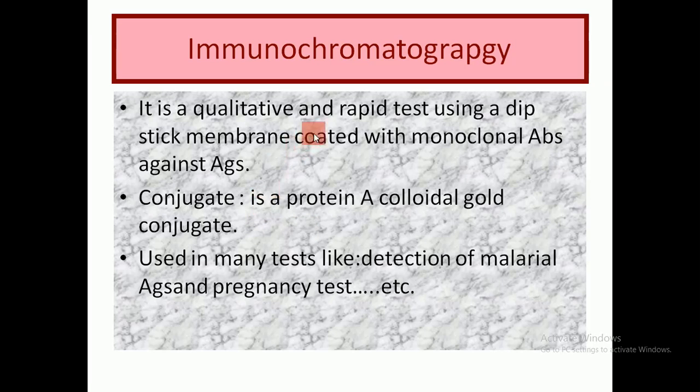And it is a rapid test within a few minutes, and it's used for early detection of the infection. And it's used either to detect the IgG, which is for the secondary immune response, or IgM, which is for the primary immune response that indicates recent infection, or the detection of IgG that indicates past infection.